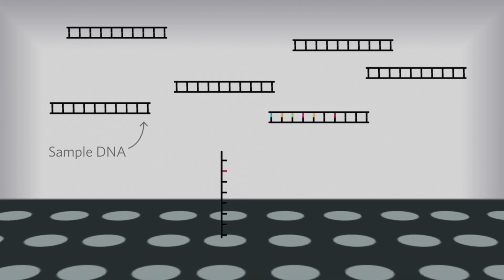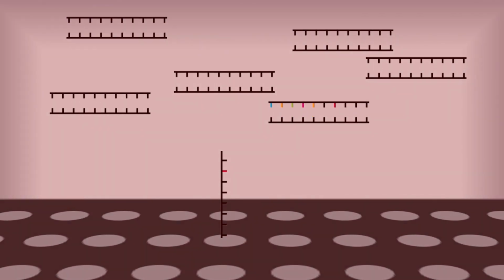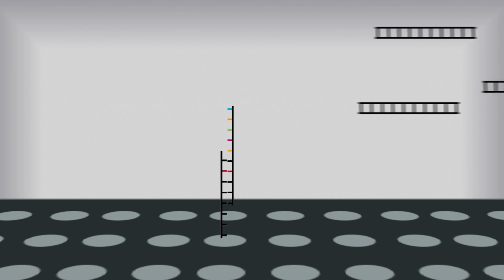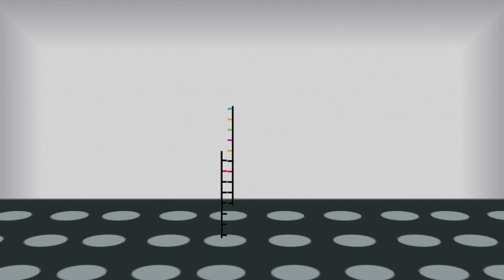Sample nucleic acid that has been extracted and/or amplified for the targets of interest washes over the slide containing the NanoGrid, which is housed within a hybridization chamber. The temperature within the chamber increases, causing the sample nucleic acid strands to denature. Then, the chamber is cooled, and as the temperature within the chamber drops, the denatured strands attach to complementary target strands on the NanoGrid, if present. The remaining unattached DNA strands are flushed from the chamber.